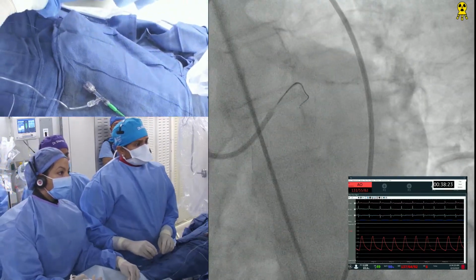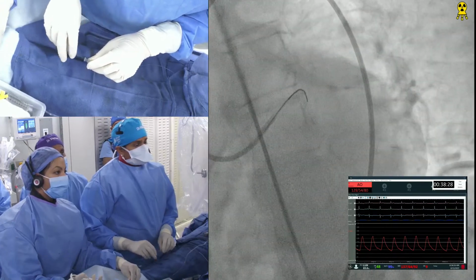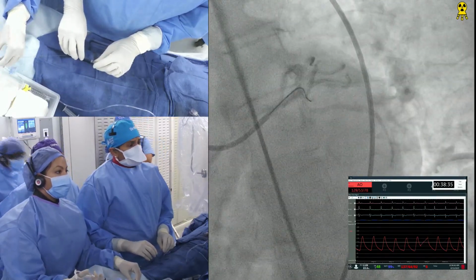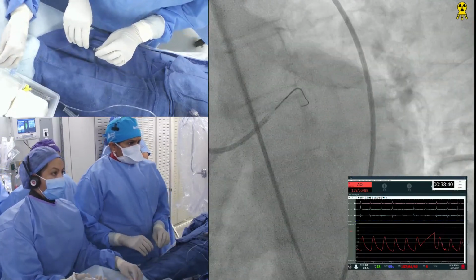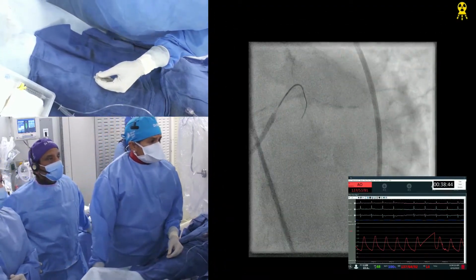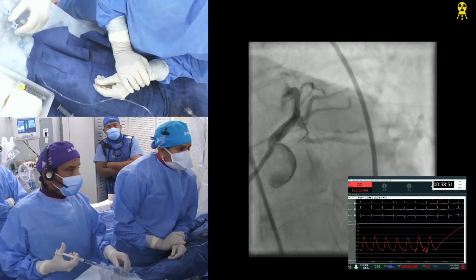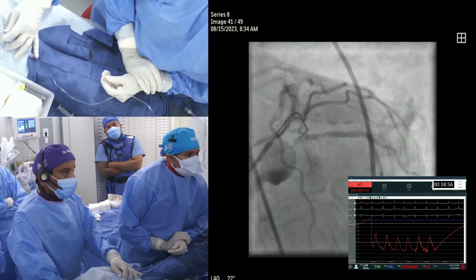It's almost a double angulation there. Yeah. It makes the first angle and then it goes into some tiny branch there, and the plaque is in the atrial branch, right. Some dye now. Oh, you're making progress. I think just a matter of persisting. There you go. Or the whisper. When it's made the first pass, let me come here now and take a picture. Yeah, I want to take a picture and then decide what is happening there. No, it is in some branch. Yeah, some small branch.